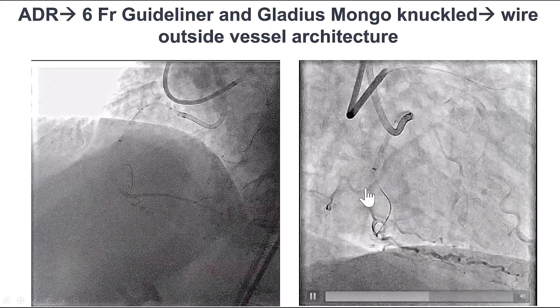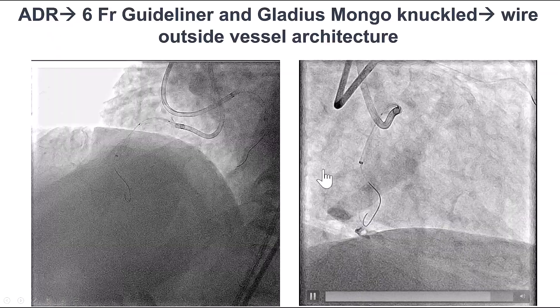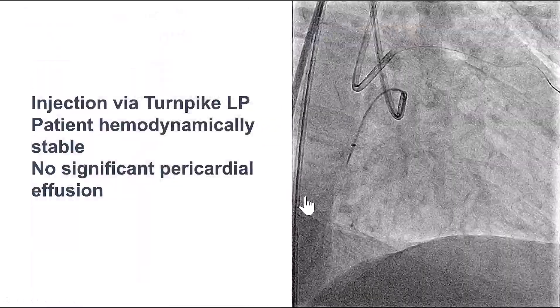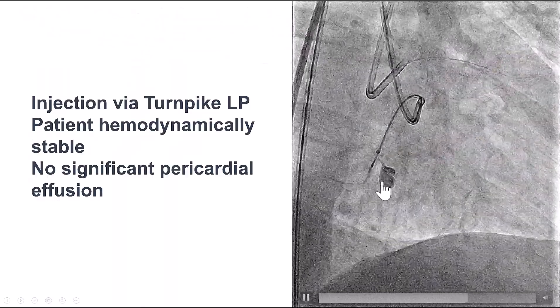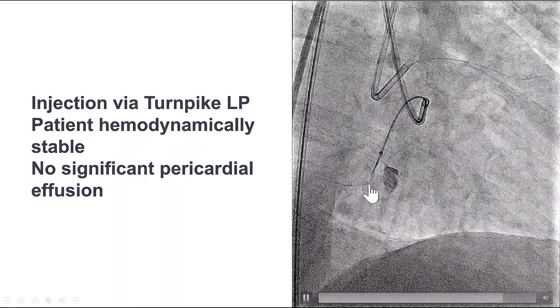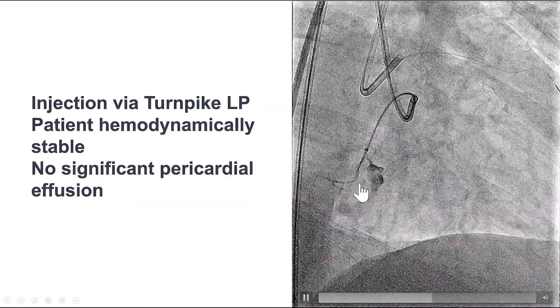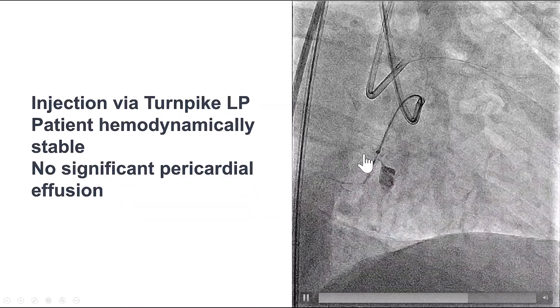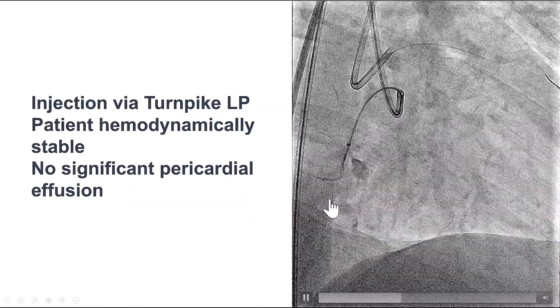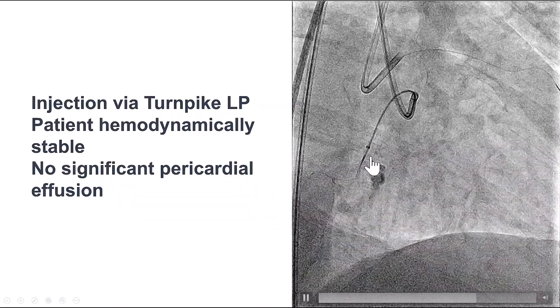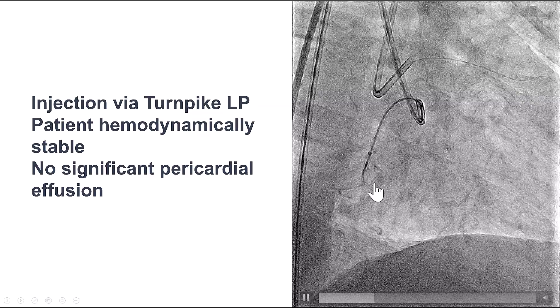This is the RCA view. We can see that the wire is not moving in the expected course of the RCA, which should go straight down. A tip injection from the Turnpike LP shows a perforation with staining. It appeared that the knuckle entered an acute marginal branch and then perforated it.